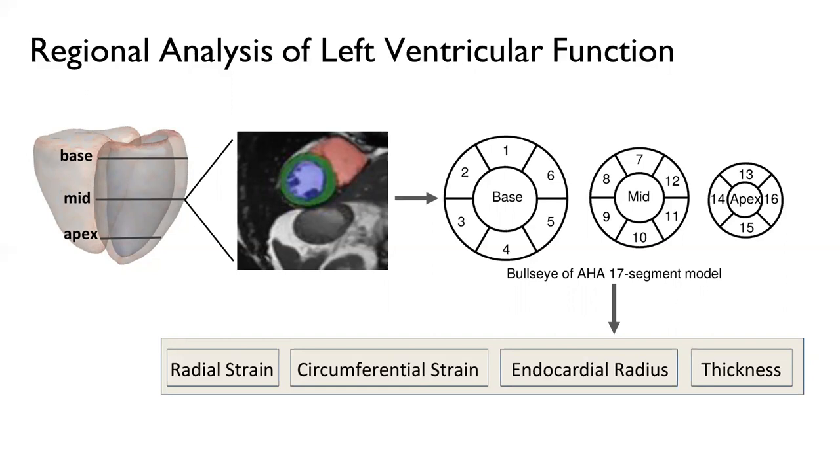Motion characteristic features, such as time series of the endocardial radius, thickness, circumferential and radial strain, are relevant to cardiac disease, and they are easy to explain as characteristics of pathological cardiac motion. Motion analysis is therefore also useful for earlier stage characterization of the disease. Here, we focus on the short axis view MRI images of the 6 segments of the middle slice.